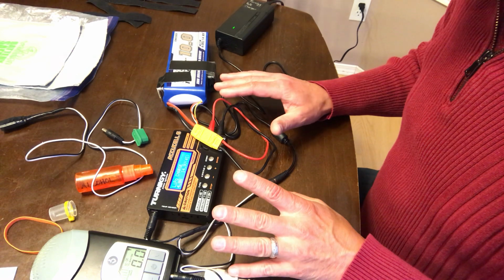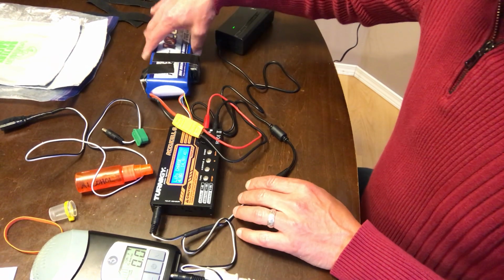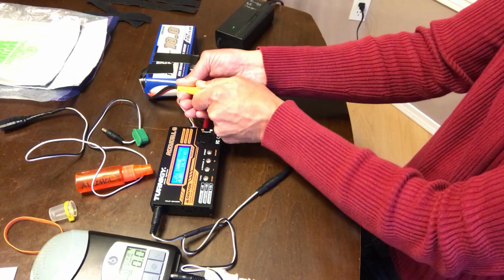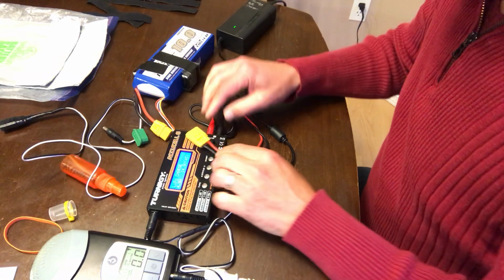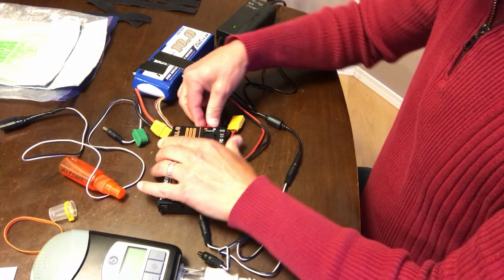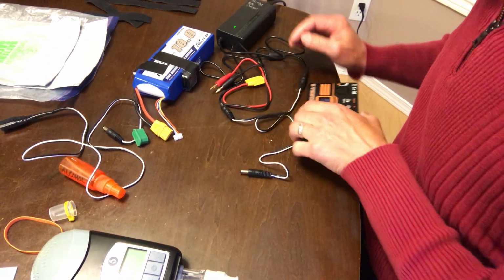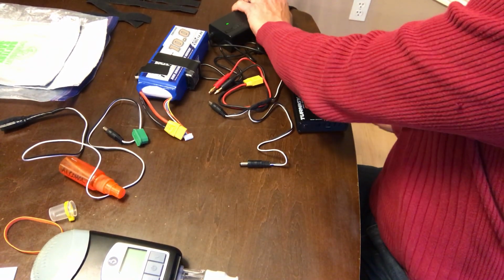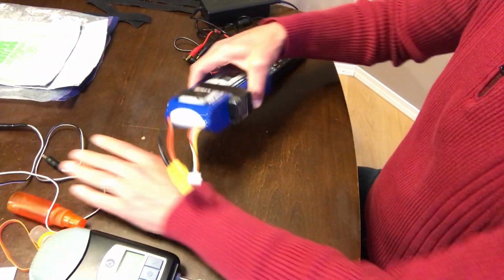Now let's say you've gone into the bush and you're ready to just use the battery. So we'll disconnect this, and this. So all of this gets disconnected. And even this wall one. Push that aside for the moment.